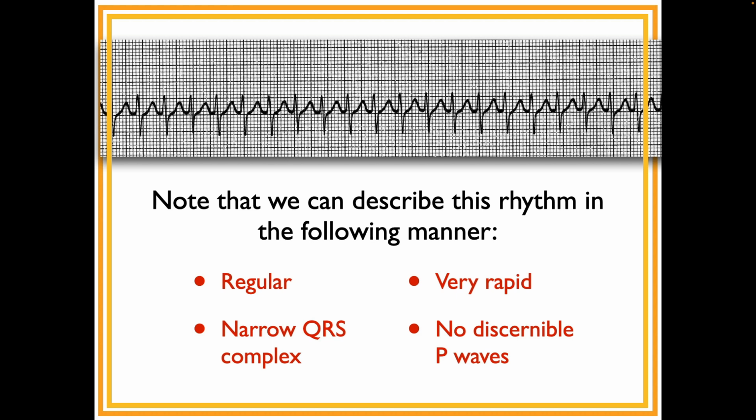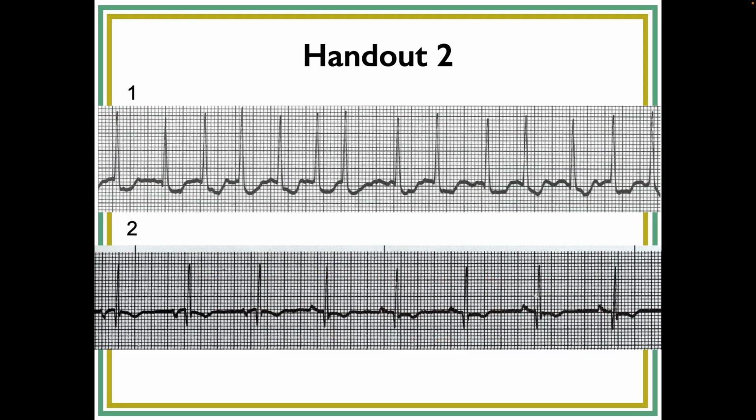Okay, so we have 10 minutes left. Let's look at handout number 2, which starts on page 19, and we're only going to have time to do a few, but I want you to see how using the 5-step process works with this. So who's got the pointer? I do. Okay. So I really want you to go through the 5-step process, and you should have your handout in front of you. Don't look up on, because you're going to need your calipers to march out. Is this regular or is it not regular? Page 19.